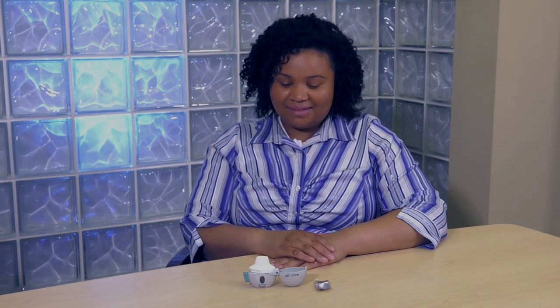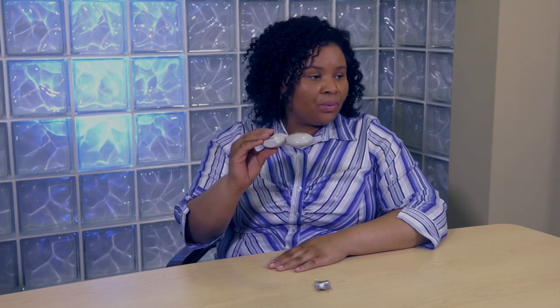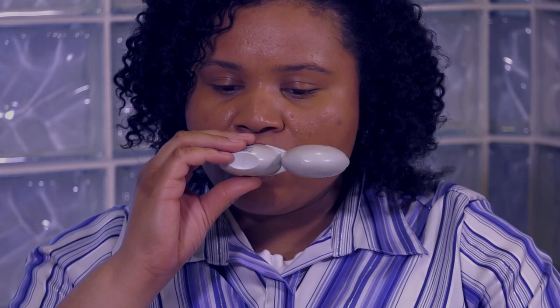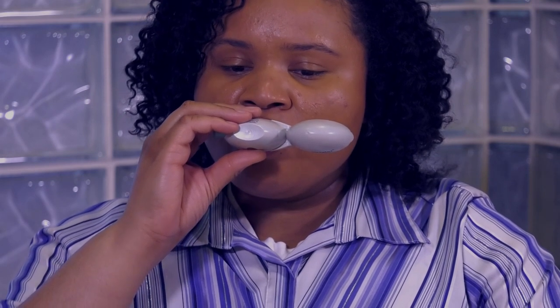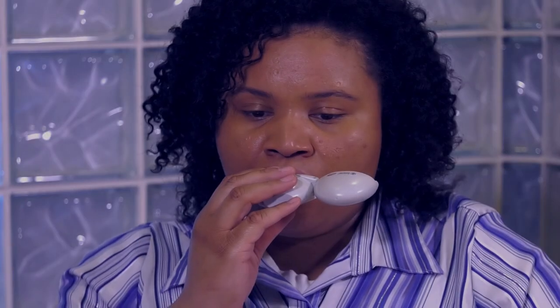While holding the inhaler level, breathe out through your mouth as much air from your lungs as you can, away from the mouthpiece. Then close your mouth around the mouthpiece. Keep your head in an upright position and breathe in slowly and deeply until your lungs are full. You should hear or feel the capsule vibrate or rattle. Remove the inhaler from your lips and hold your breath for about 10 seconds or for as long as comfortable, then breathe out through your nose slowly and calmly.